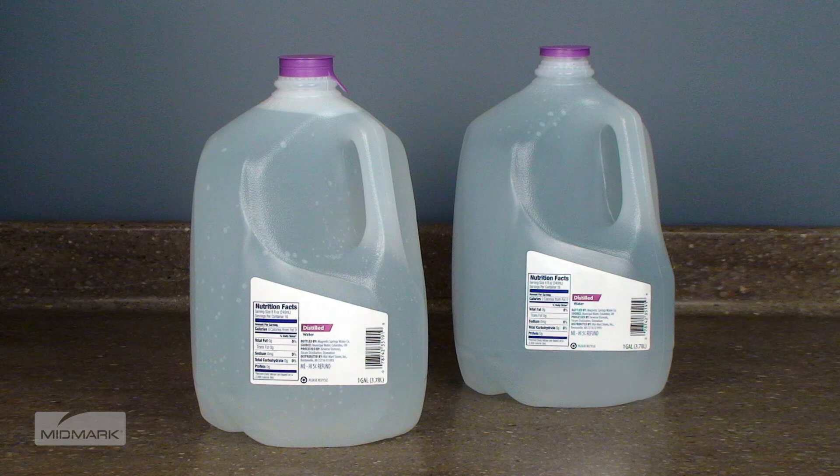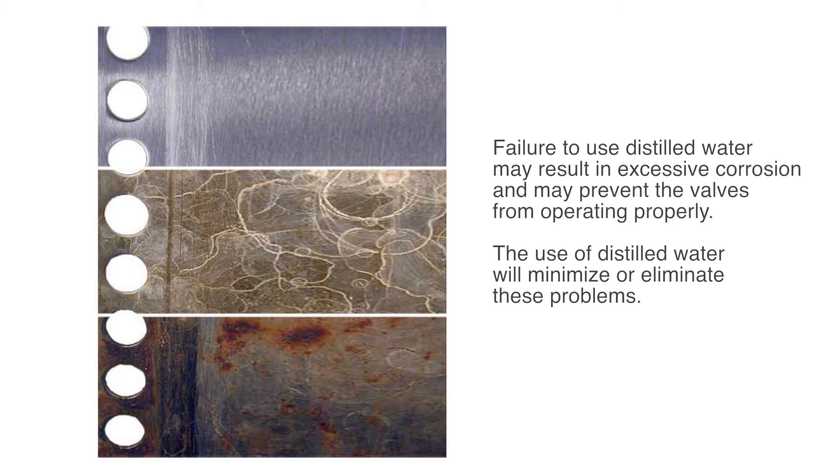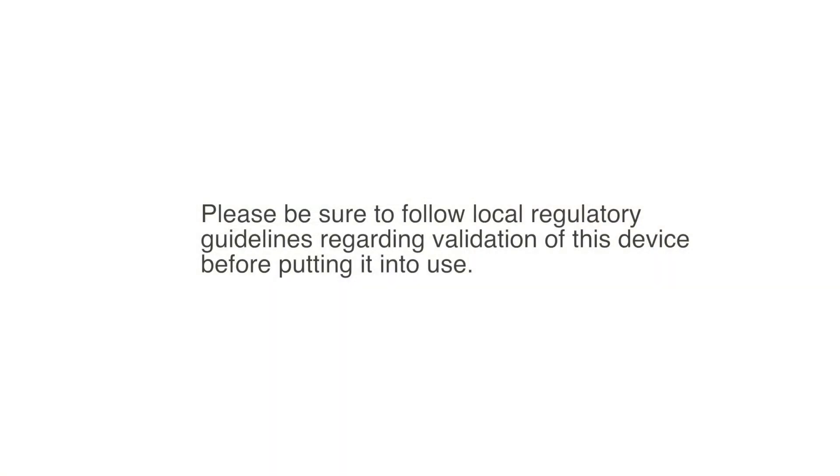Now, you'll want to fill the reservoir with clean, distilled water. It's very important that only distilled water be used. Since the autoclave operates with high water temperatures, any minerals dissolved in the water will form mineral deposits. Failure to use distilled water may result in excessive corrosion and may prevent the valves from operating properly. The use of distilled water will minimize or eliminate these problems. Pour the distilled water into the fill port. Do not fill above the lower lip of the fill port. Please be sure to follow local regulatory guidelines regarding validation of this device before putting it into use.